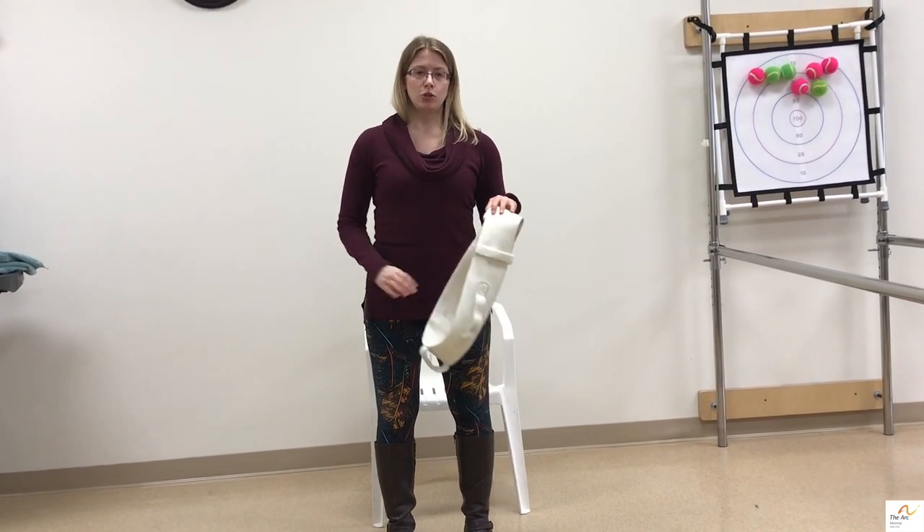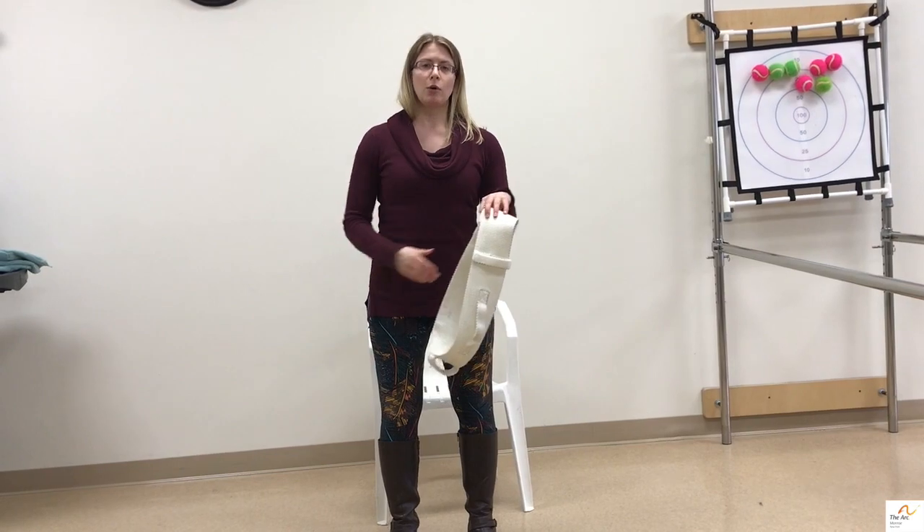If someone has a g-tube, make sure that you put the gait belt above the g-tube site so you don't irritate it while you're working with someone.